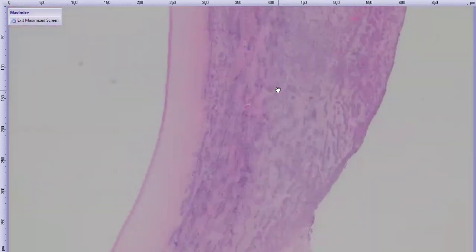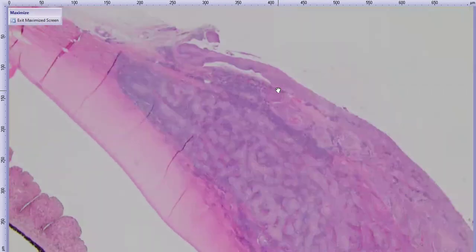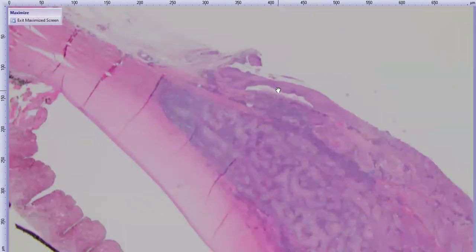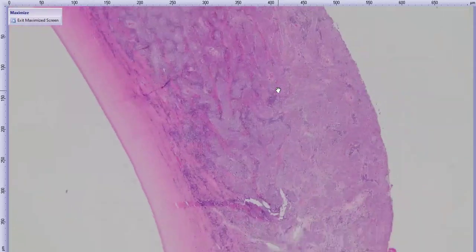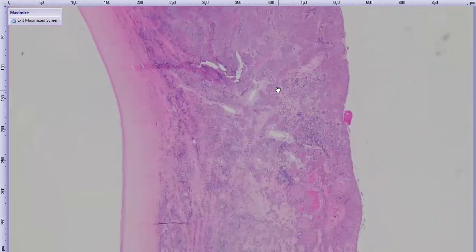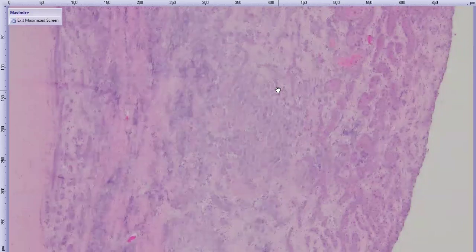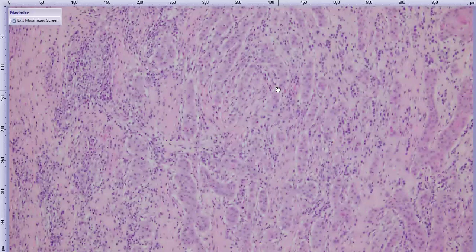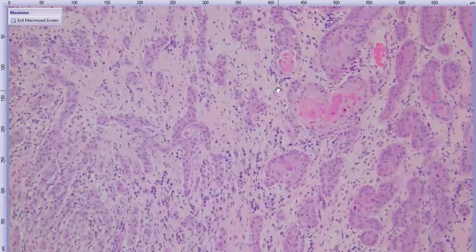All right, cornea's to our right this time, because apparently that's my habit and I never realized until recently. But anyway, we have this neoplastic population mostly infiltrating the corneal stroma and thickening the stroma itself. It's not actually forming much of an exophytic mass above the ocular surface. And if we look closer at who these cells are, they are little lobules and anastomosing cords of epithelial cells against a fairly desmoplastic looking stroma. Lots of reactive spindle cells in that stroma. Here we go.